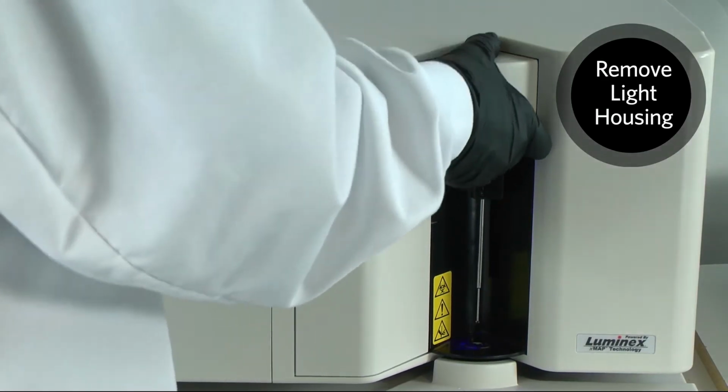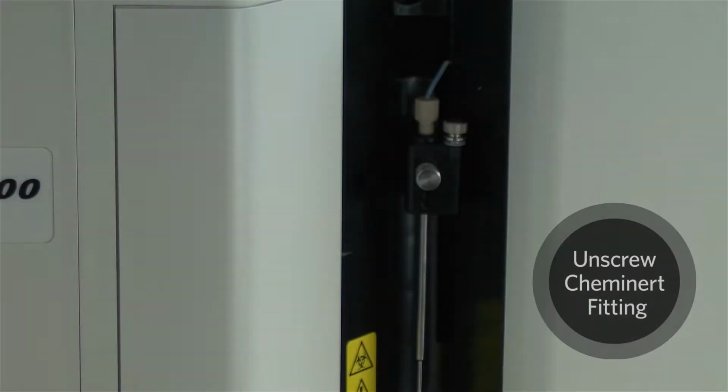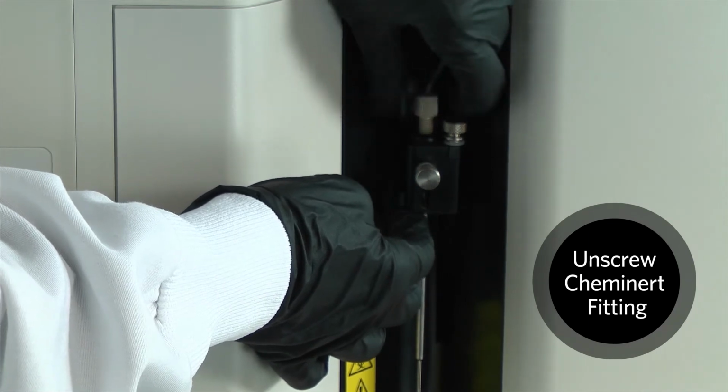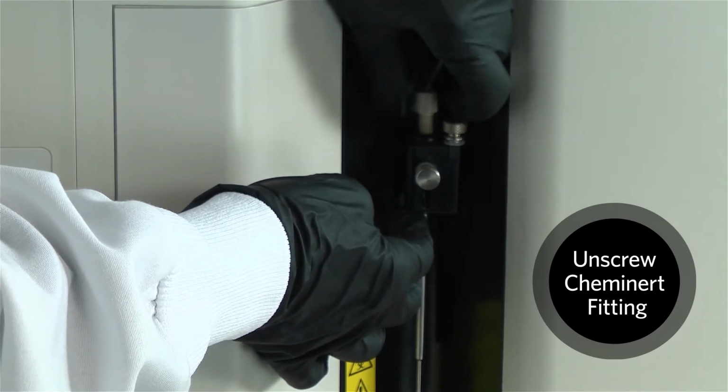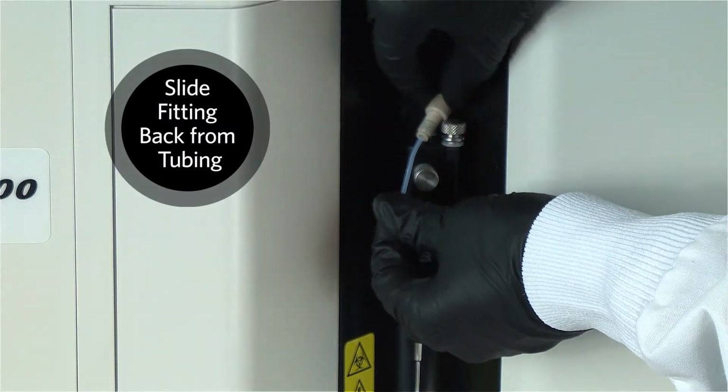Remove the light housing above the sample probe. Unscrew the Cheminert fitting above the sample probe. Slide the Cheminert fitting back from the end of the tubing.